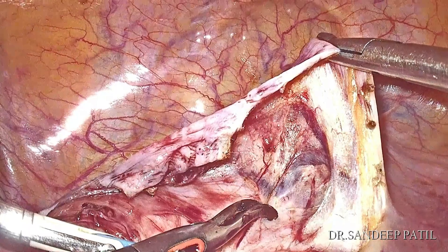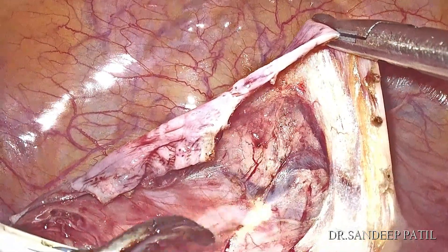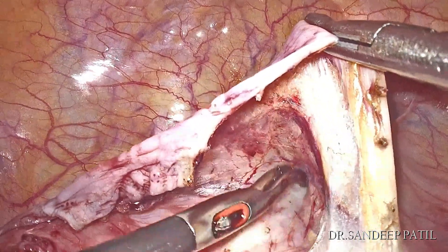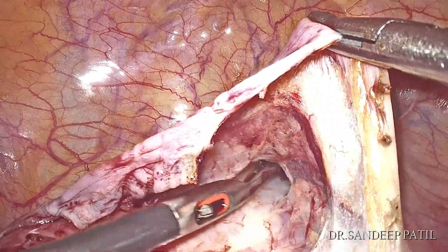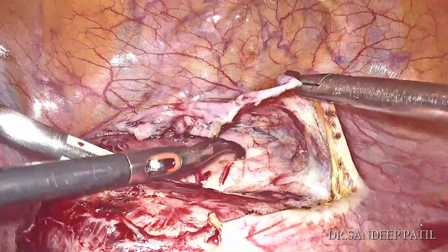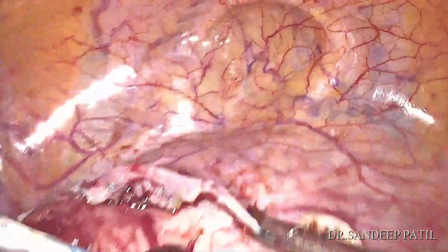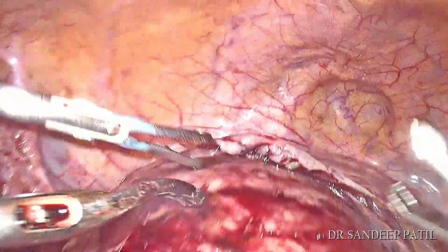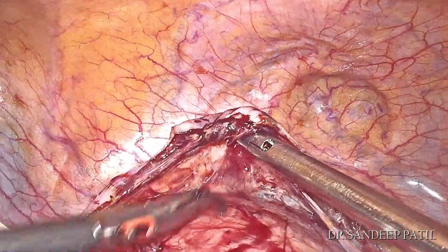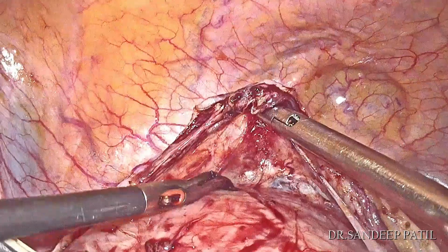One has to take proper precautions not to open vessels running in that area, and this is achieved by dissection in a proper plane. Once the UV fold is incised adequately and the bladder is mobilized caudally, we move on to the next step.